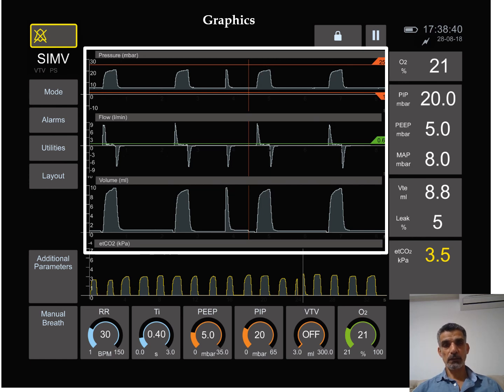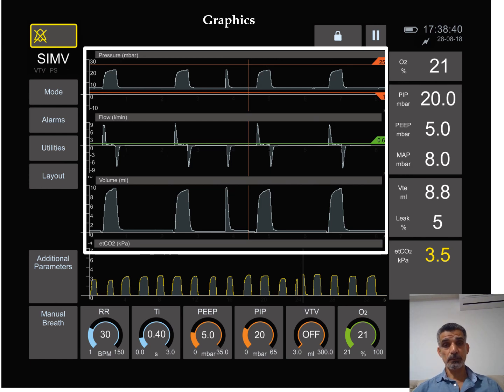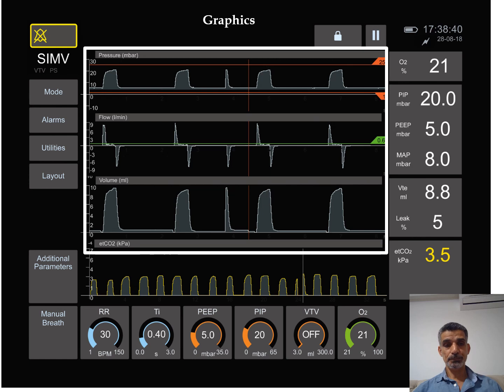And then you can see the pressure. There are always lines in here which is the trigger line. It is the pressure or the flow that can be made by the baby before the ventilator can help. And also you can see some alarm lines for the pressure and also for the volume.